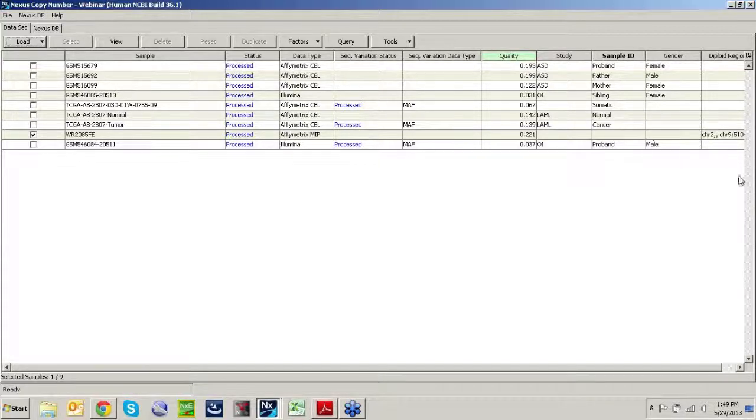Is the quality index for Illumina systematically smaller than for Affymetrix? And if yes, why? So every array has a different range of quality scores that we typically observe. This has to do with the variability in the differences of probes and the technologies used between different arrays.